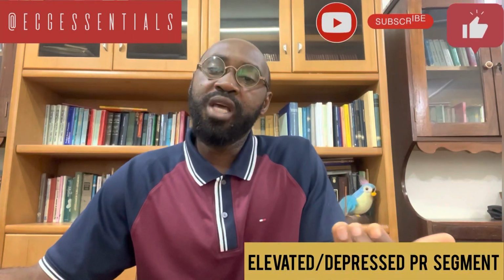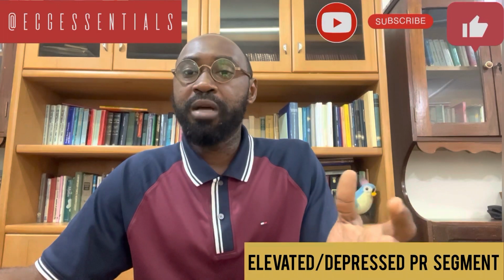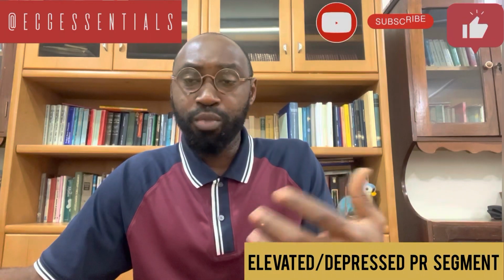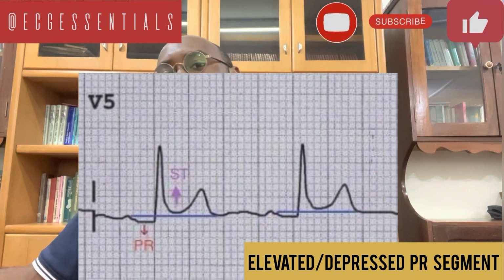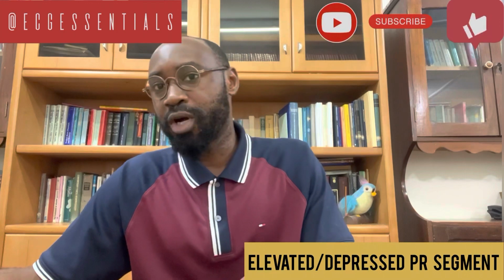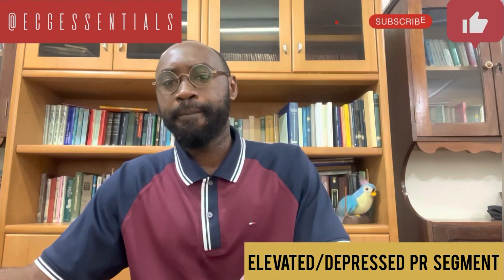For example, in a situation like acute pericarditis, in the early stages, we expect widespread saddle shape ST elevations in most leads, and we also expect to find PR segment depressions together with these ST elevations that we commonly talk about. So in acute pericarditis, PR segment depression is a very significant finding, right?